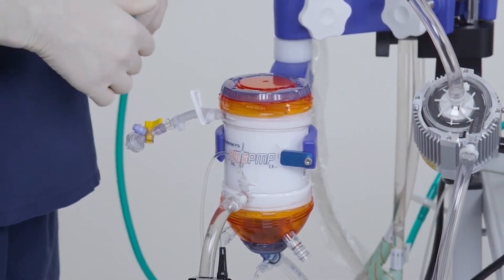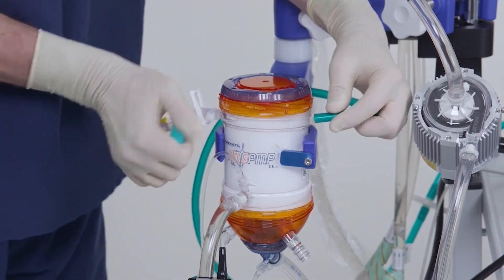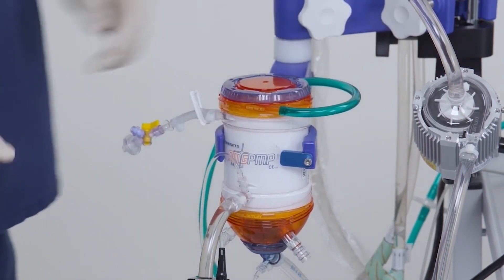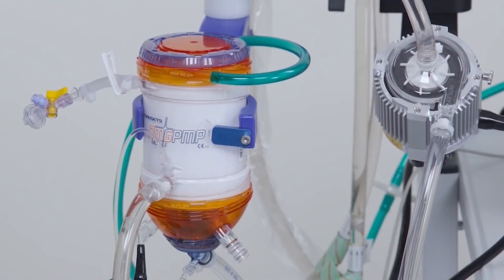Connect the green gas line to the oxygenator gas inlet connector. This line will provide the gas supply to the oxygenator. The circuit is primed and ready for use.